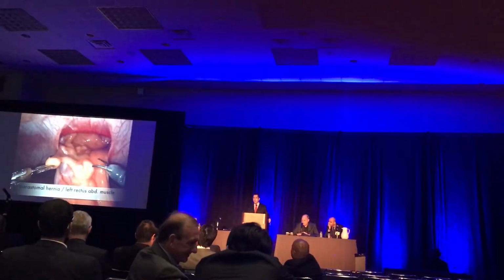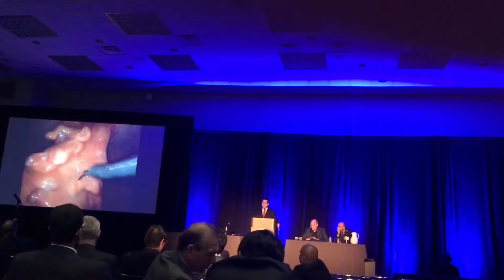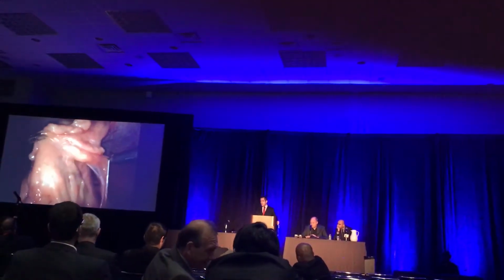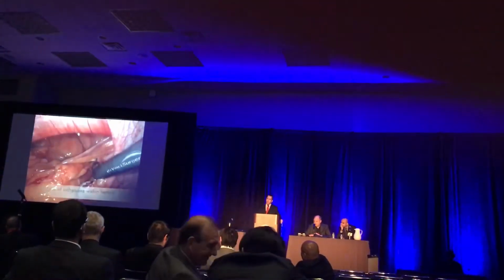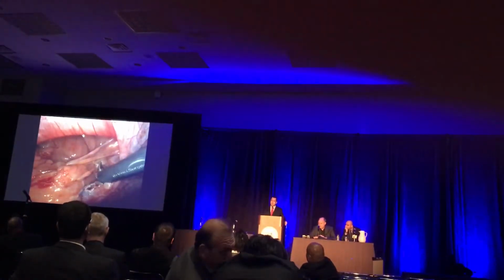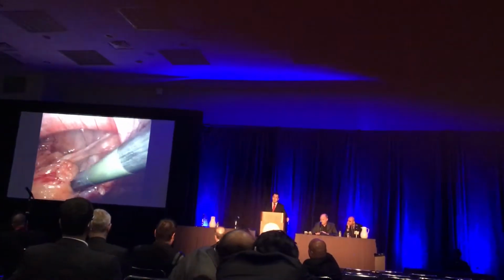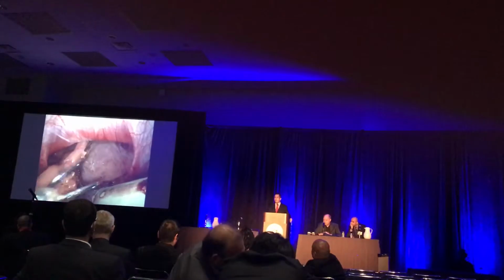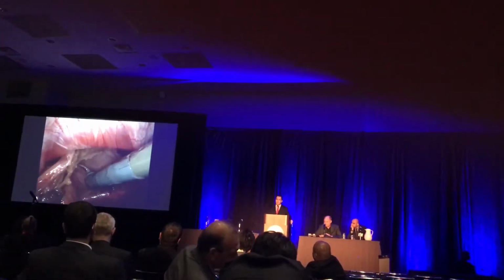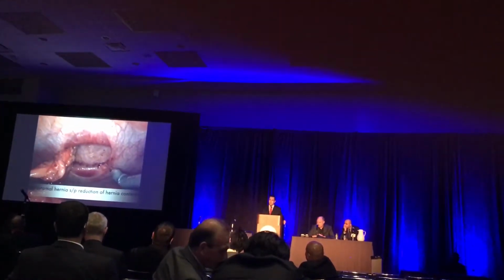The dissection is started by reducing the hernia contents and at the same time protecting the stoma and its mesentery. This can be tricky. One way that we help identifying which one is the stoma is by putting a Foley catheter in it and inflating the balloon. The dissection then is performed with a combination of sharp dissection and blunt dissection. And again, being very careful to preserve and protect the stoma itself.